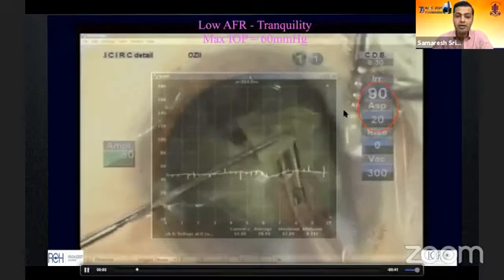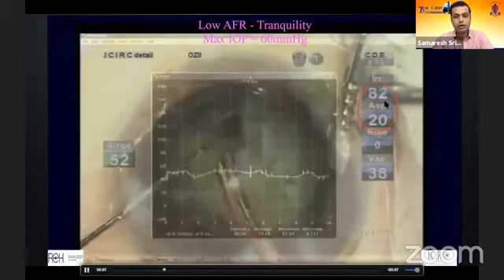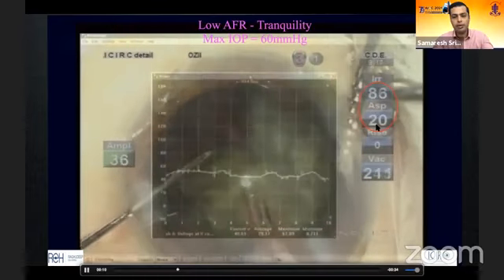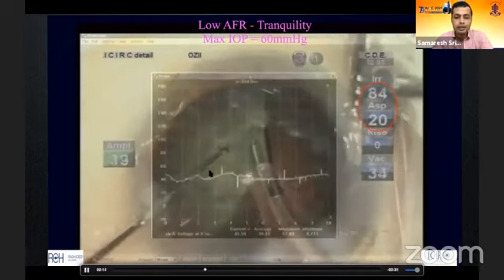And compare it to what we defined as a low parameter group, where we used a bottle height of about 75-80, a flow rate which was exactly half, about 20. Notice that the maximum IOP hit during this surgery was about 60 millimeters of mercury.